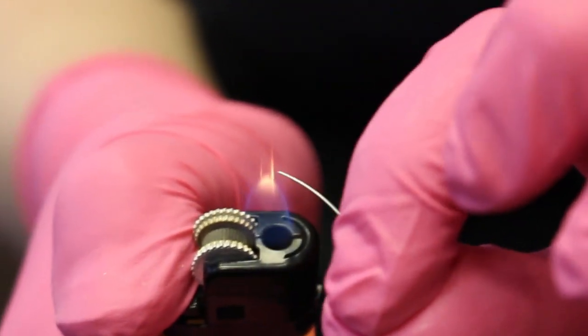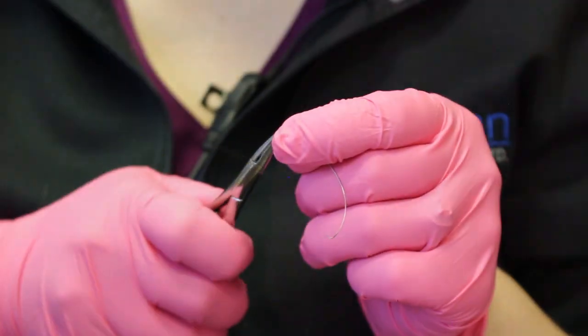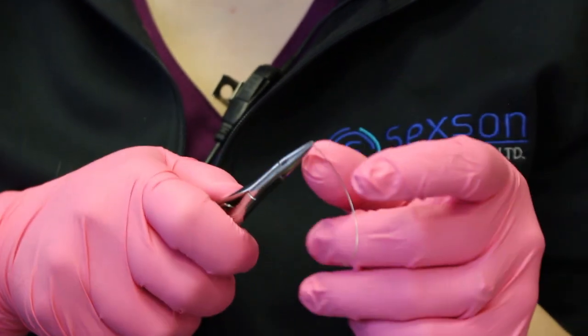Those wires are so flexible that they don't bend. So we flame the ends, which kind of kills the wire properties and anneals them, so we can actually bend the end part.